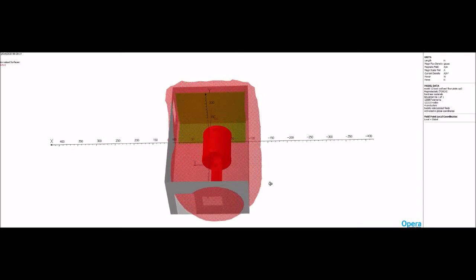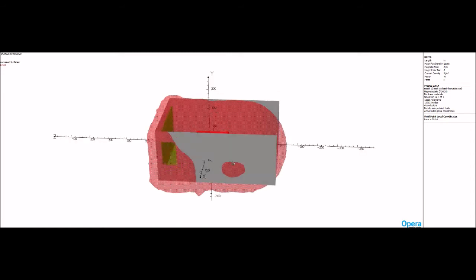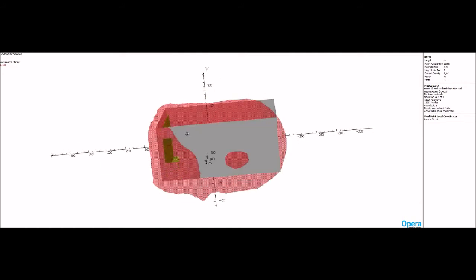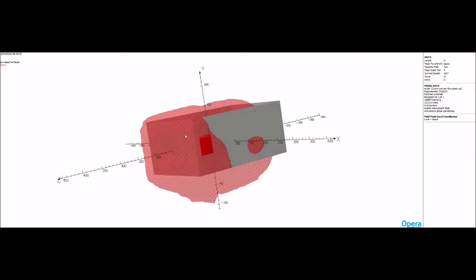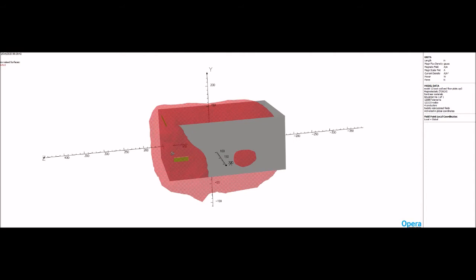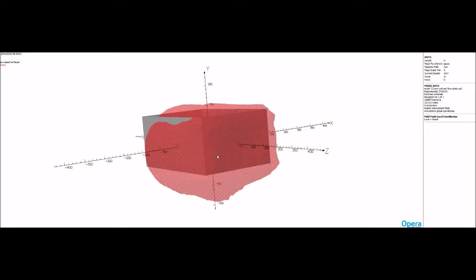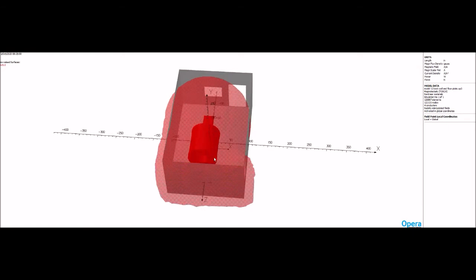We added steel now on the floor behind the magnet. This helps to prevent the 5 Gauss from sneaking out underneath. It doesn't prevent it 100%, but it does pull it back in. You can see this steep slope here. That's from that floor plate attempting to prevent the 5 Gauss from coming out. It also, you can't tell on this display, but we measured it, and the 5 Gauss on the back wall has been pulled in by several inches. It's a process. As you add more steel, you get more mitigation of the 5 Gauss line.